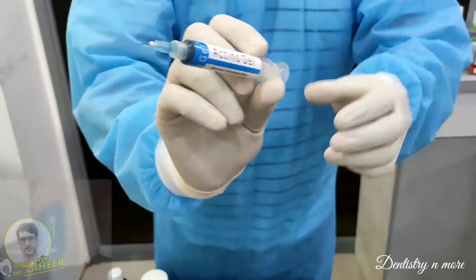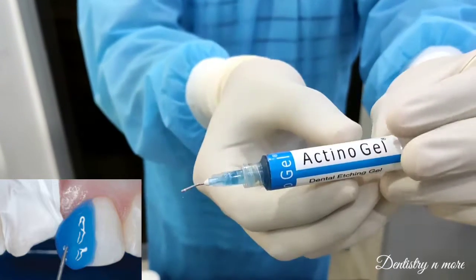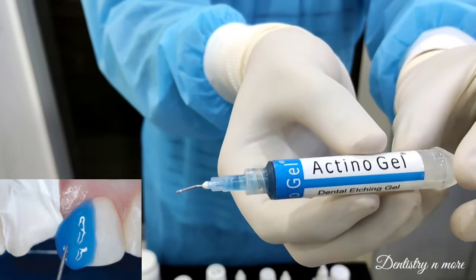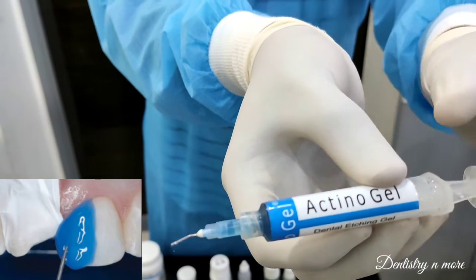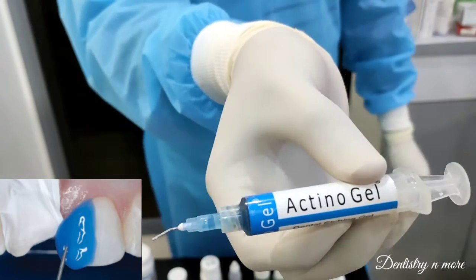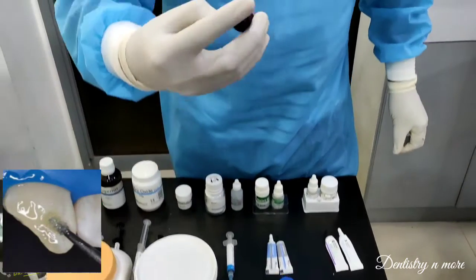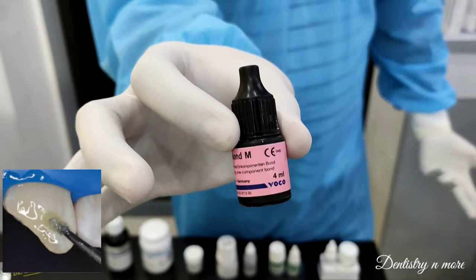This is a gel which is an etchant. It contains acid intended to create micro-porosities on the enamel surface. When applied, it causes demineralization, removes enamel surface, creates micro-porosities, and increases surface energy. It is the first step of composite restoration, because composite has to bind to the tooth surface with the help of a bonding agent.